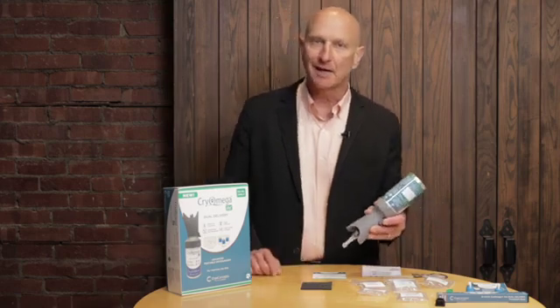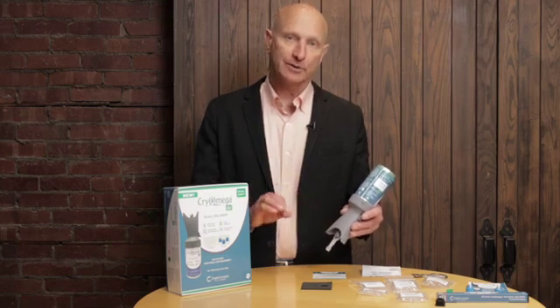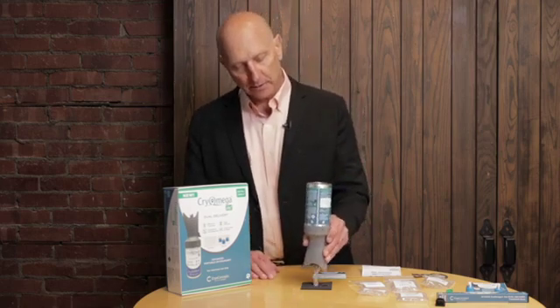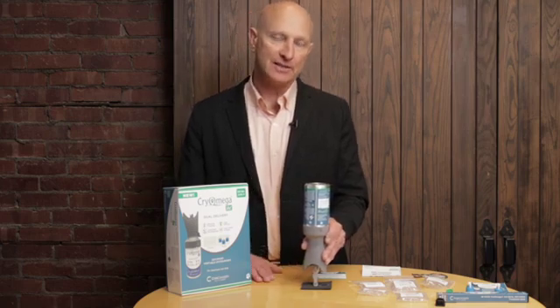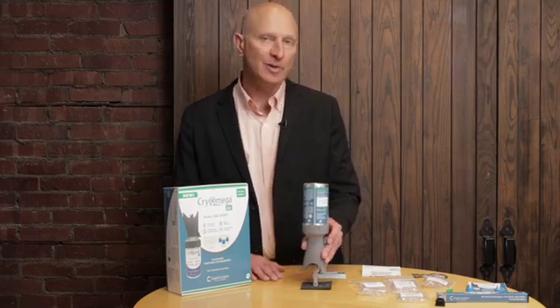There's still some left behind. It's very efficient in my demonstration. You would wait for the flesh color to return to the spot that you treated. It'll be white to begin with because you froze it. Once it turns back to flesh color, then you can treat it again. This is commonly called the freeze-thaw cycles. Now, freeze-thaw cycles may be anywhere from 1 to 5, depending on the lesion, and this will come with some practice.